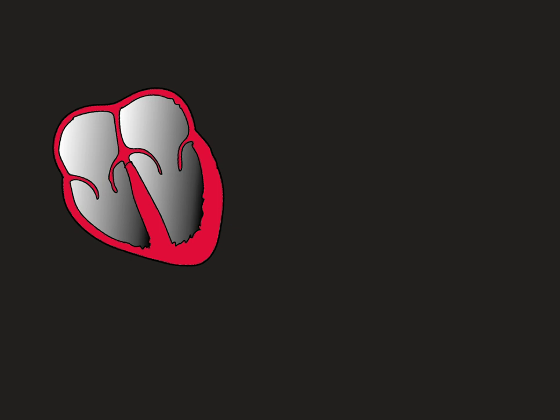And then finally, the last number you will see, which is normally down in the bottom right hand corner, is something called the SVV, which is stroke volume variation. And this is telling us how dry or well filled the patient is, and it's expressed as a percentage.